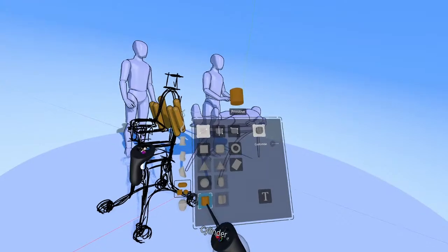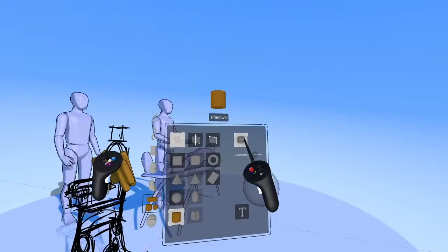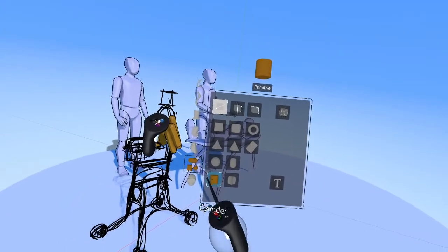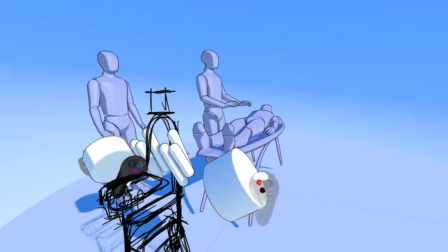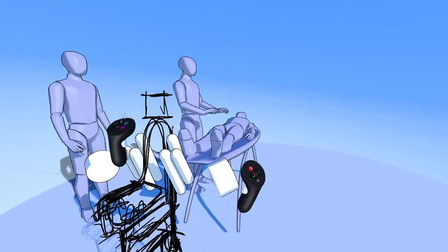So we're going to come here to the purple menu, primitive shapes, turn off sub D, and you'll see why I'm turning it off in a little bit, and we'll select the cylinder. So let's just preview something, drop it in the space, that's good enough. And let's figure out these hinges. The reason I turned off sub D for the cylinder is I actually just want to use this as a primitive shape right now.